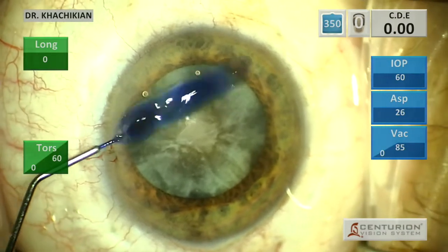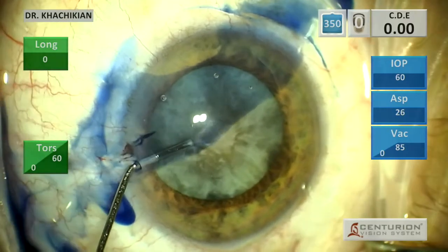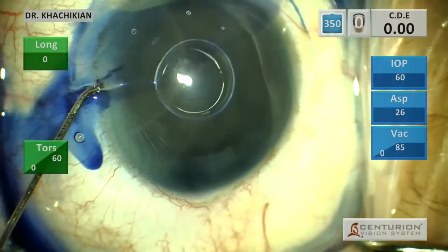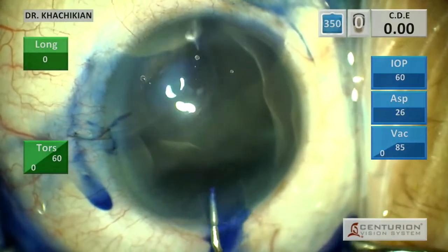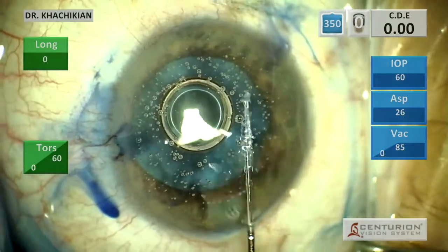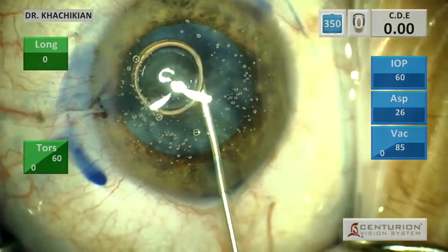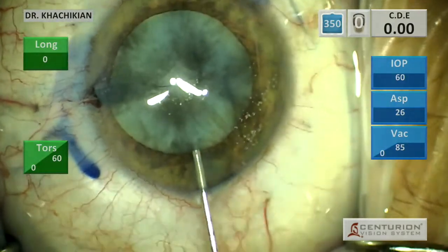We will begin the case by using some TriPan Blue to stain the capsule. Initially I inject the TriPan Blue under air in an attempt to stain the anterior capsule, and for most cases that works fairly well. It is not my preferred technique, but it is certainly easier than placing the TriPan Blue under viscoelastic. In this case I found that staining the anterior capsule with TriPan Blue under air didn't really provide the staining I was looking for.